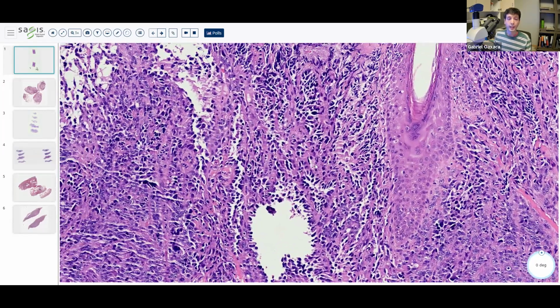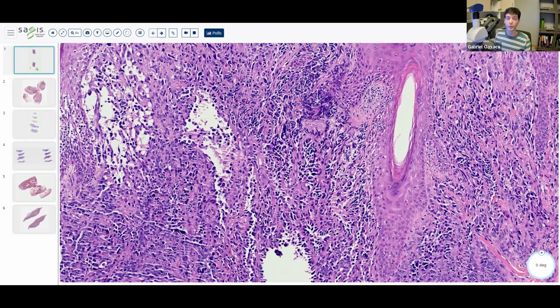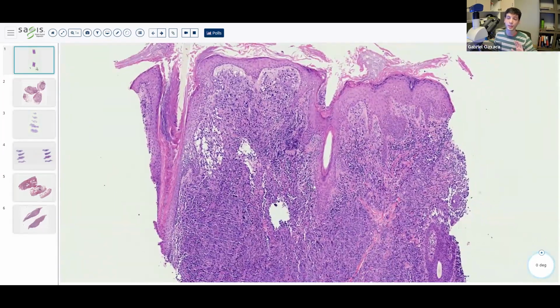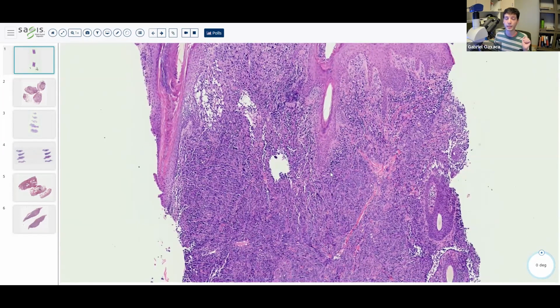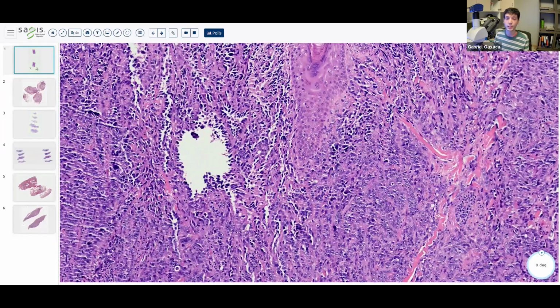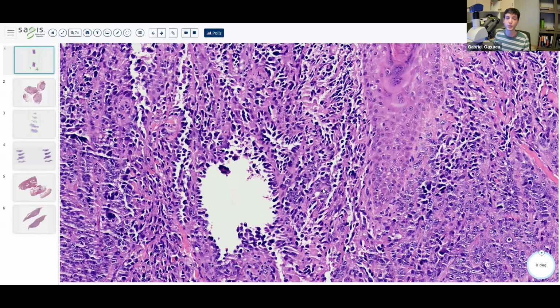All right. And if we're working this case up from what I like to call the very top, like a brand new fresh case, I would also put on a cytokeratin and a melanocytic marker because that would enter into the differential, especially on the head and neck of an elderly individual. Lo and behold, this tumor is strongly and diffusely positive for CD31 and ERG. And at this point, the only overtly malignant vascular tumor is an angiosarcoma. And given the morphology, it is actually an epithelioid angiosarcoma.